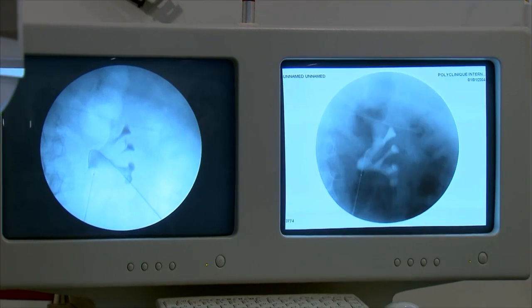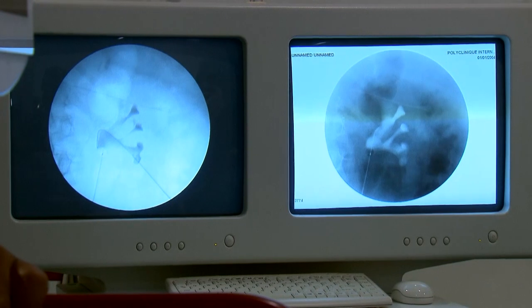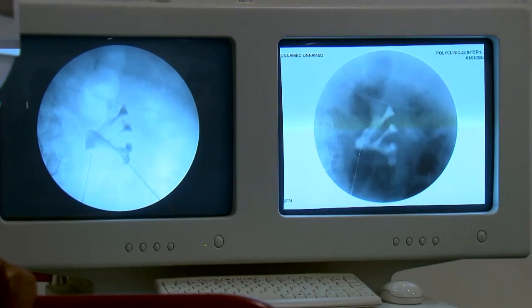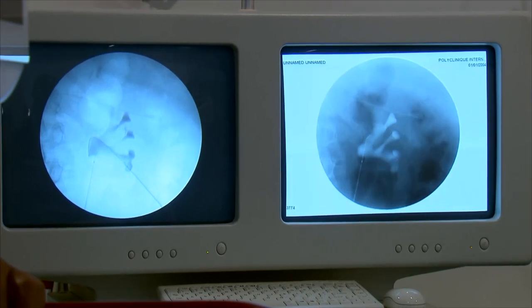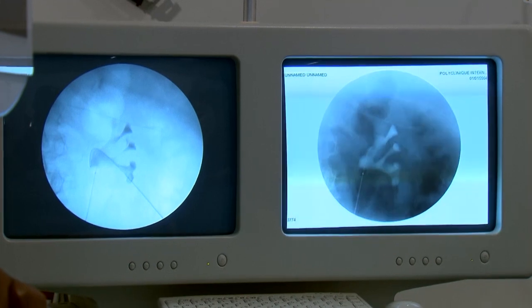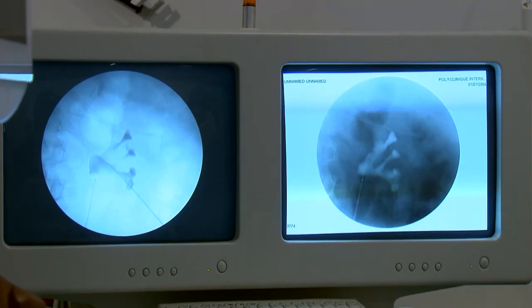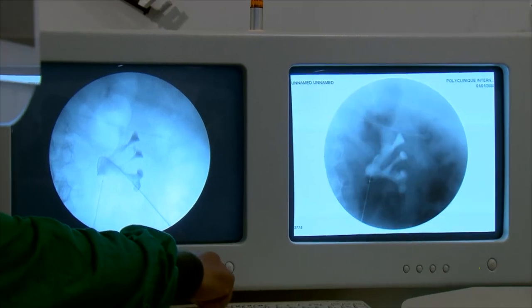Okay. Stop. There are two possibilities. Place the tip of the guide wire into the ureter, or into the upper calyx. Upper calyx, yes. But never alter the medial wall of the renal pelvis. Okay. Now we are going to dilate the tract. I think it is a good approach to the calyx and to our stone burden.